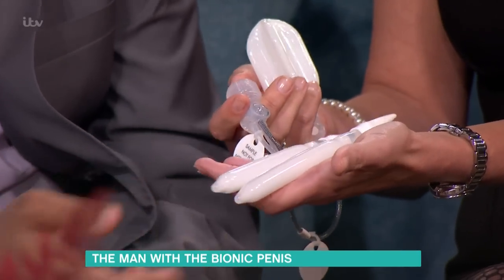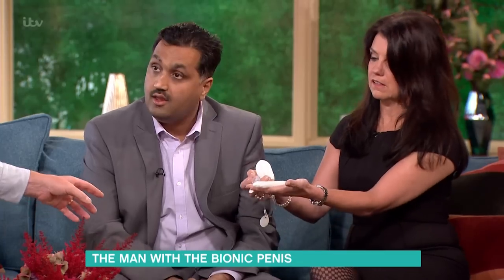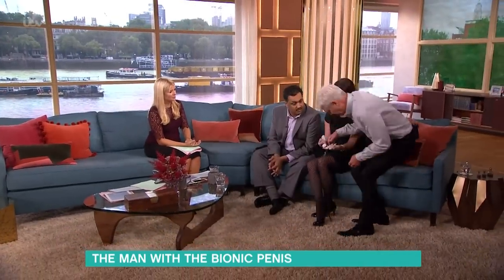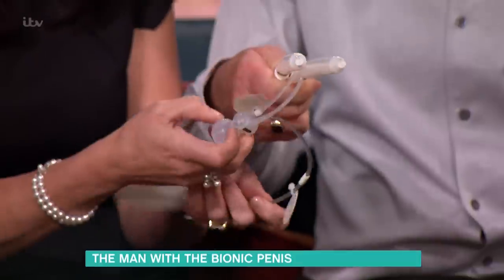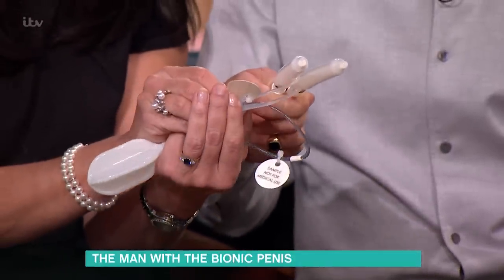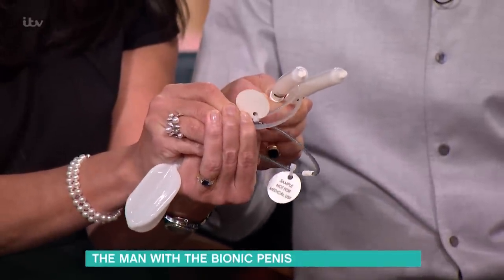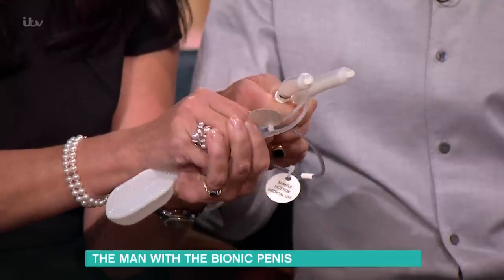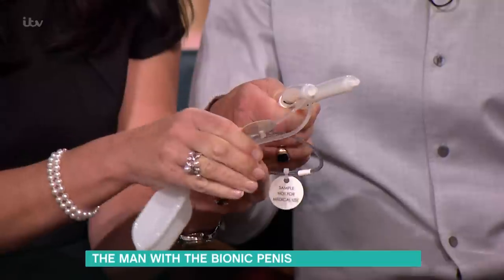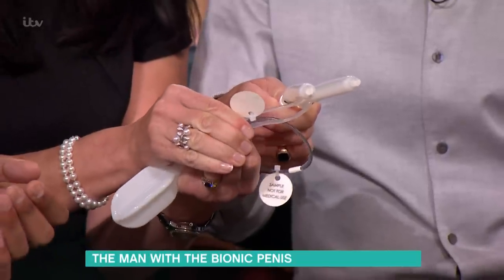When they're sitting in your hand they look very similar. So when inflated it's like that. Then how do you release it? You press this button, which is again underneath the skin. Watch — it's going to deflate. You do have to press quite firmly.